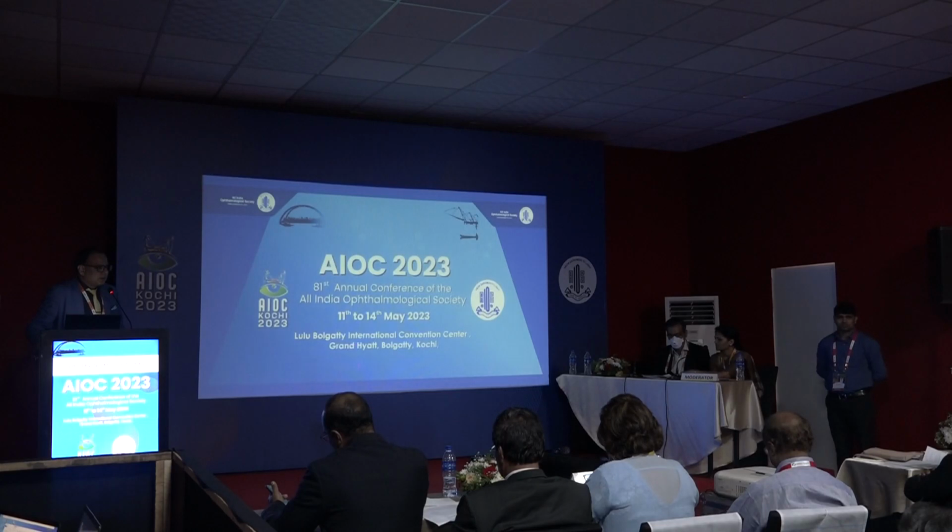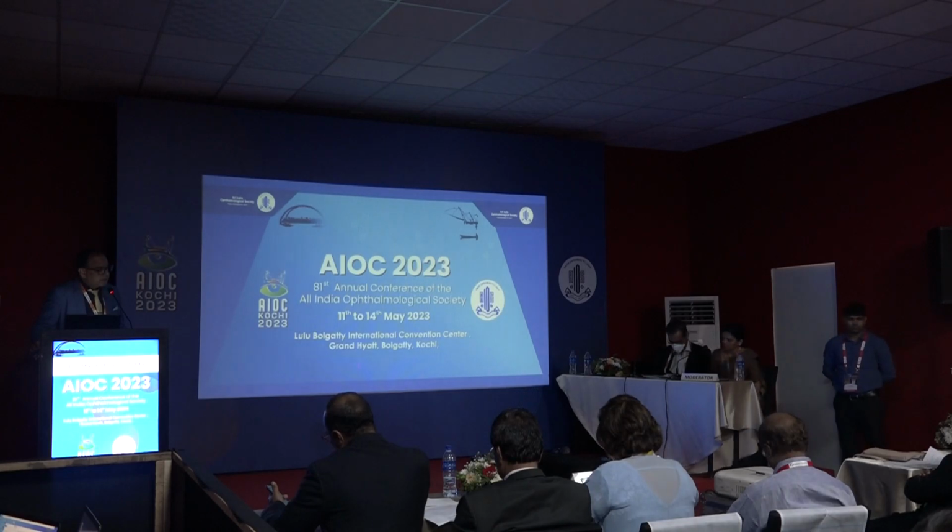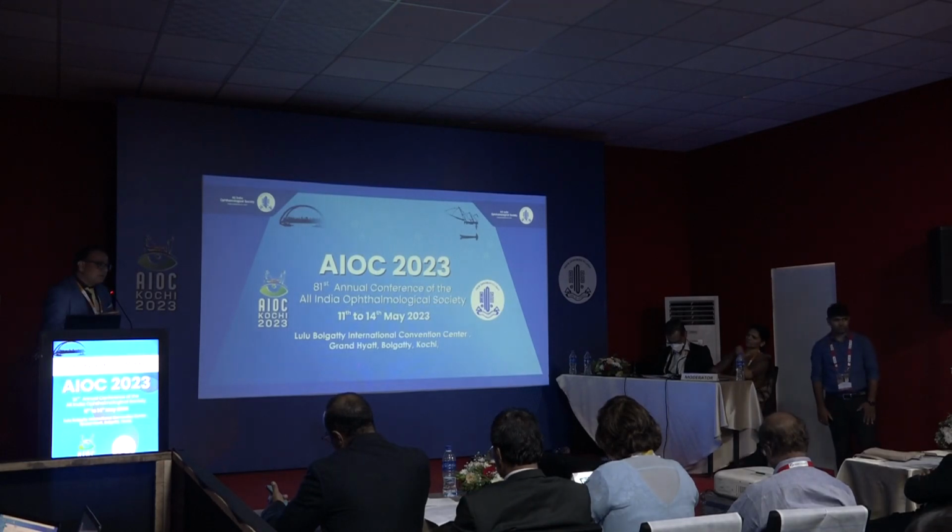How important are the remaining steps like capsular staining, deepening the anterior chamber, and softening the eye? How good are those steps? Yeah, those are very important steps. Because I have shown in the video the central tapping and the use of the cohesive viscoelastic. All these steps play a very important role in preventing the Argentinian flag sign.